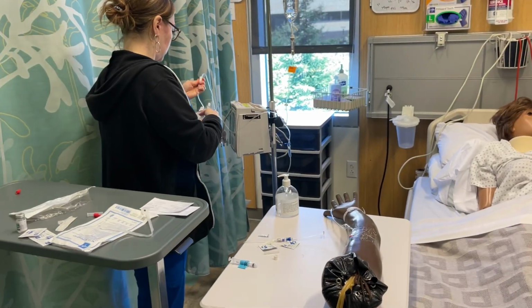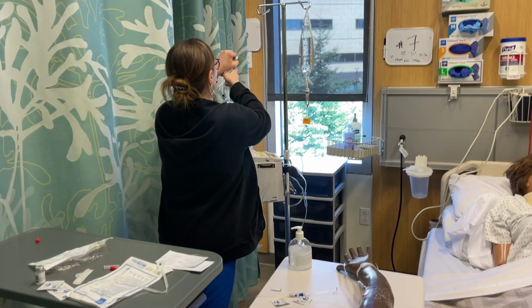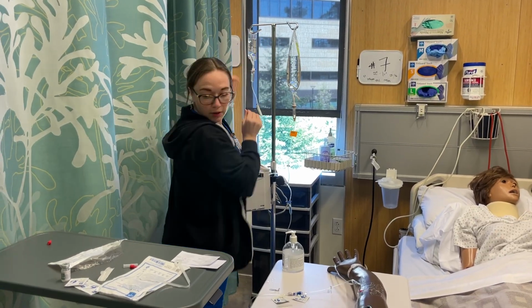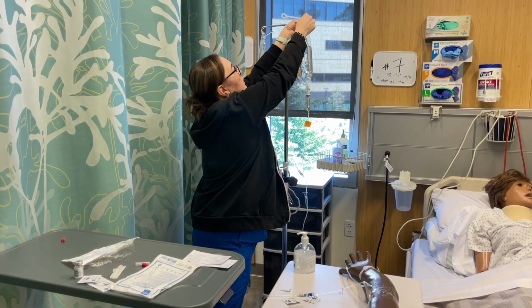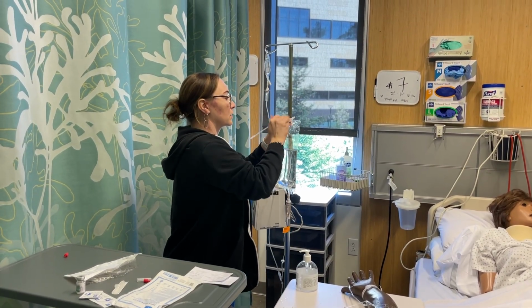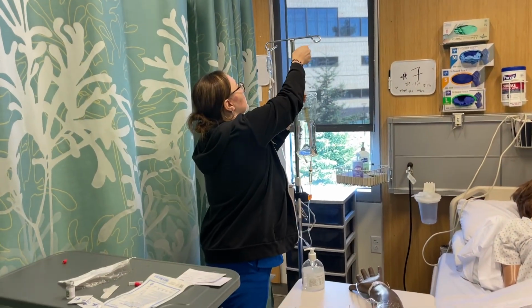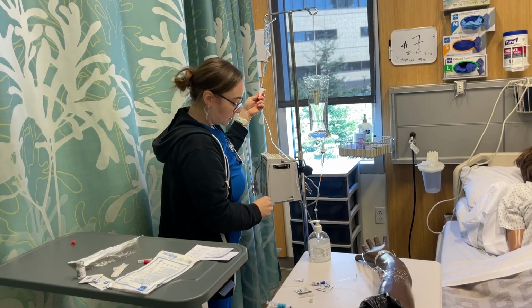She got UTIs with that, and her lab showed that. The primary line lower. And we're going to infuse the secondary line over a half hour, per the notes from the doctor. A normal setting for 125 milliliters per hour.